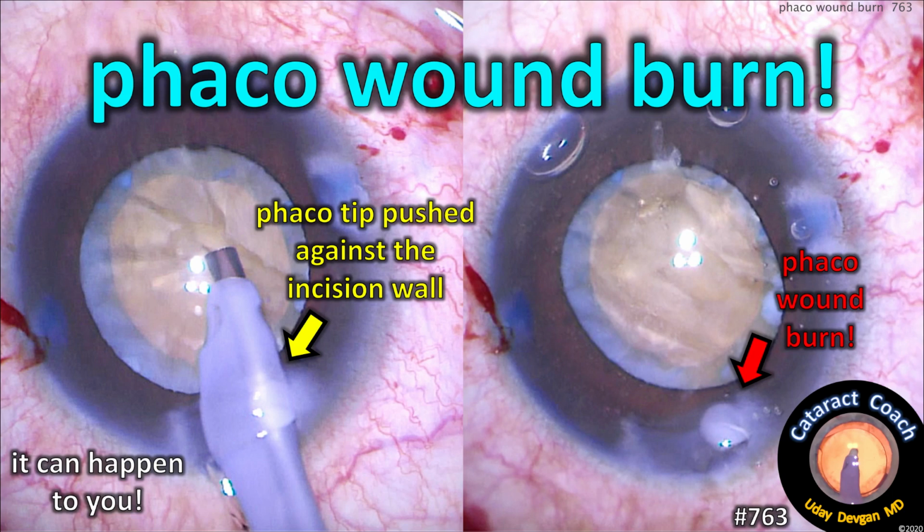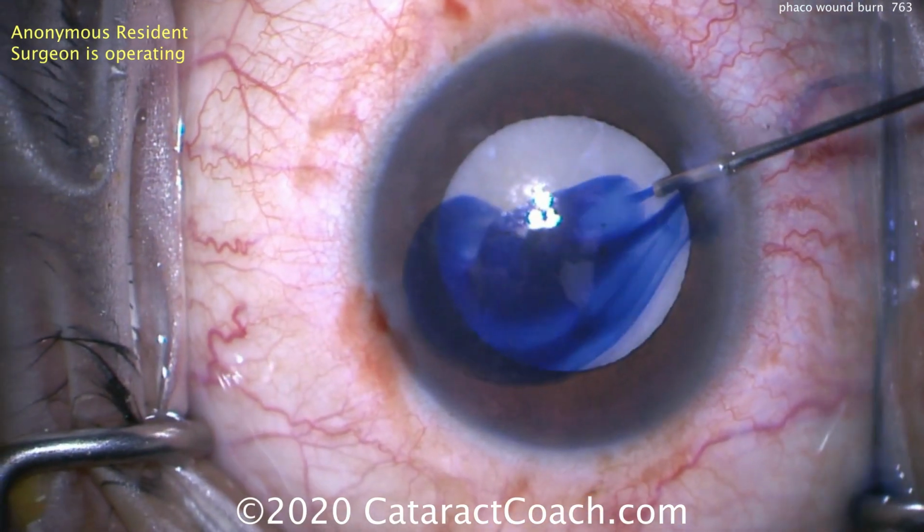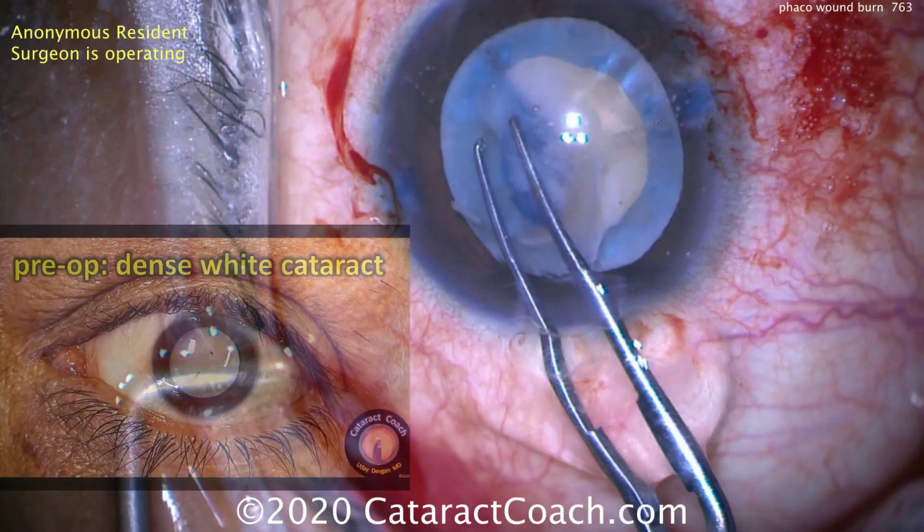cataractcoach.com. Phaco wound burn. This can happen to you, and it damages the cornea. Here's why it happens. So we have an anonymous resident who's operating, filling the capsule bag with trypan blue. You know this part of the surgery.